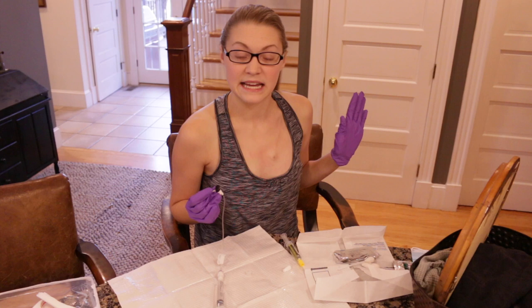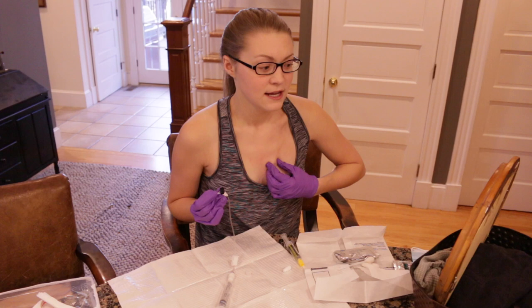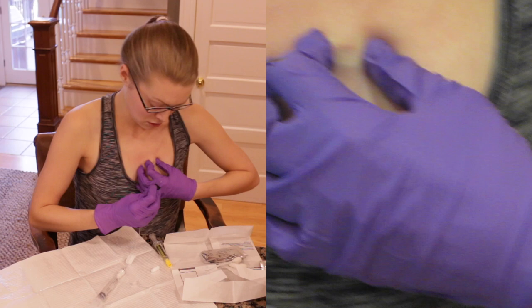My most important tip is: spread the skin over your port, grab it and spread it. That helps a lot. Now when you spread it, as you can see, it can move the port a little bit, so you want to be careful to keep it in the right place. You just spread the skin and then stick the needle in. I've got my skin spread, I'm looking in the mirror here. Do I have it clamped? Okay, the tubing is clamped. It is primed.